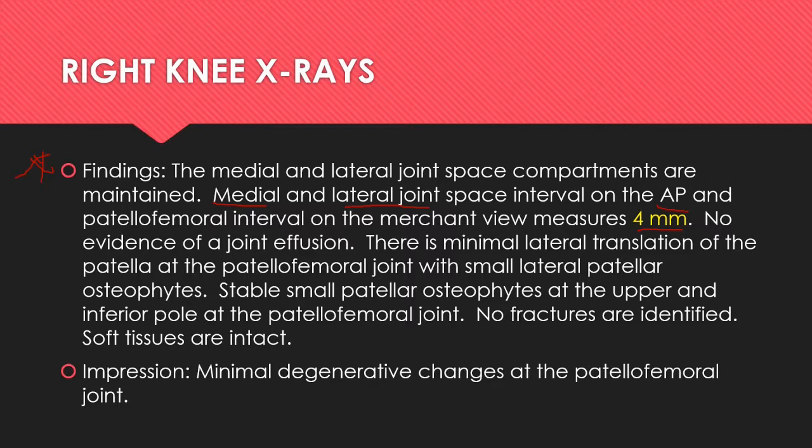Now, we're going to see by reference to the AMA guides, these cartilage intervals are well within normal limits and do not qualify for permanent impairment. So, at least according to the medical radiologist, this particular examinee does not qualify for permanent impairment due to post-traumatic arthritis because the cartilage intervals are well within normal limits as described by the AMA guides. There's no evidence of a joint effusion. There is, however, minimal lateral translation of the patella at the patellofemoral joint with small lateral patellar osteophytes.